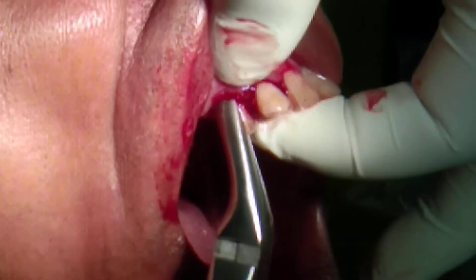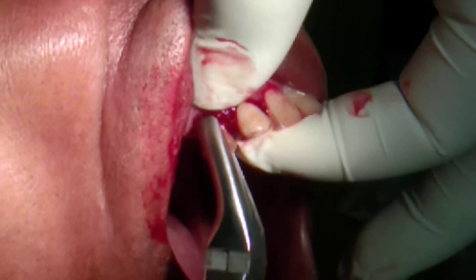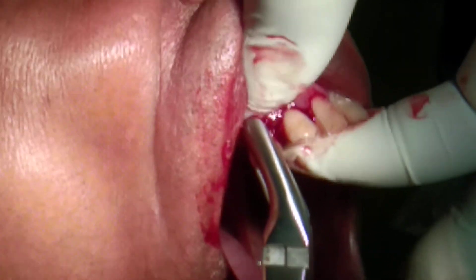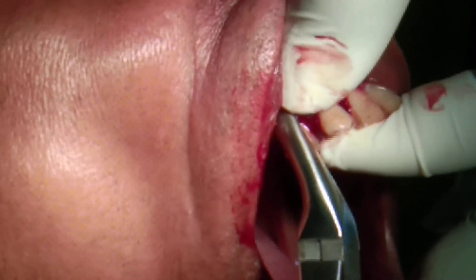Since I have luxated the tooth, now it is time to deliver the tooth. This is basically a canine. And the first force that you apply with the forceps is the apical force, so that you get a good grip of the tooth.